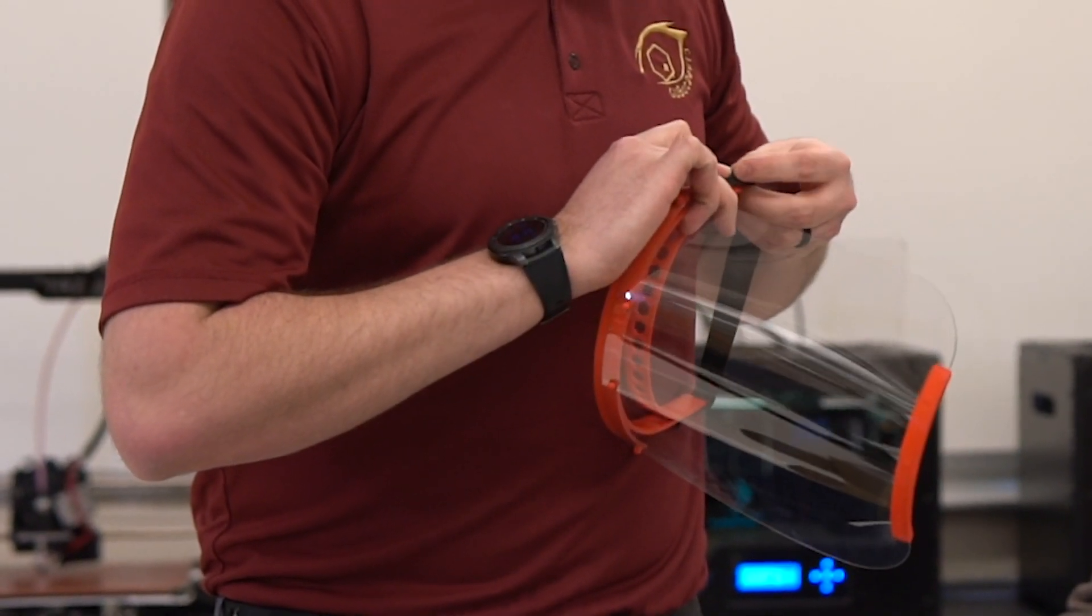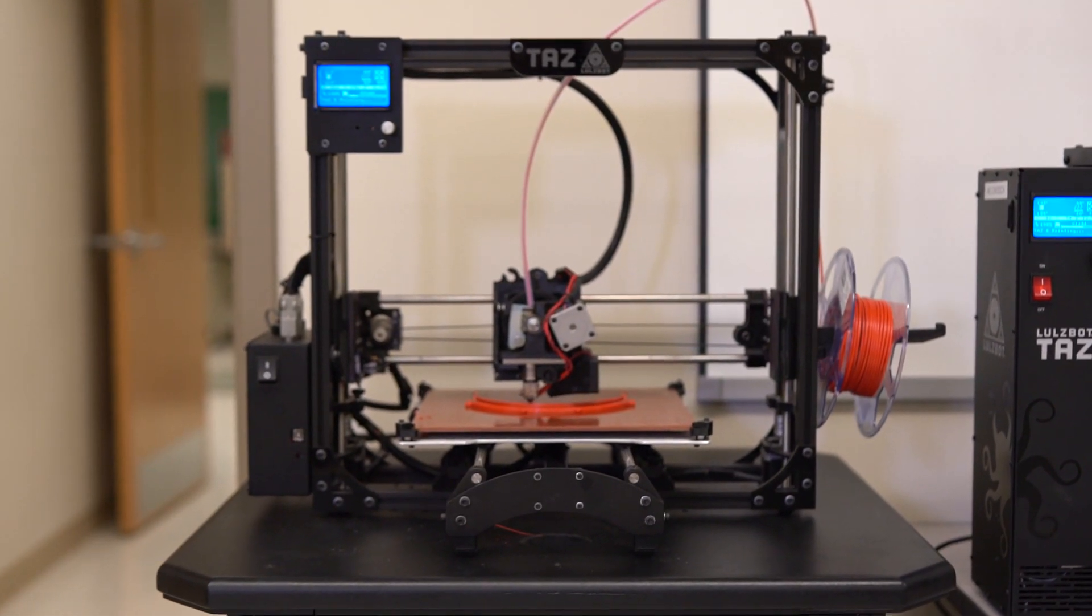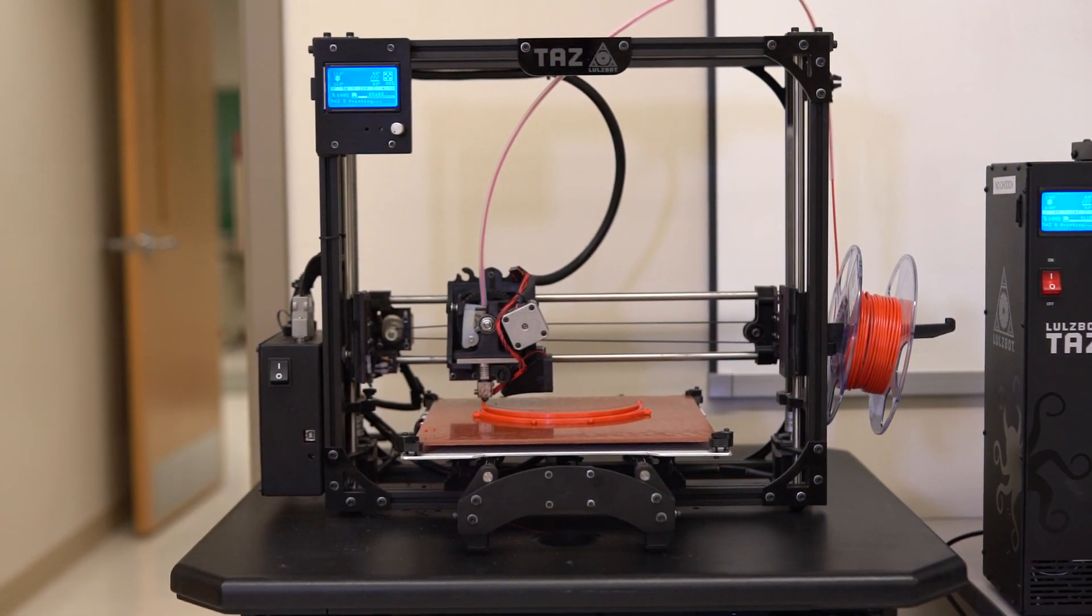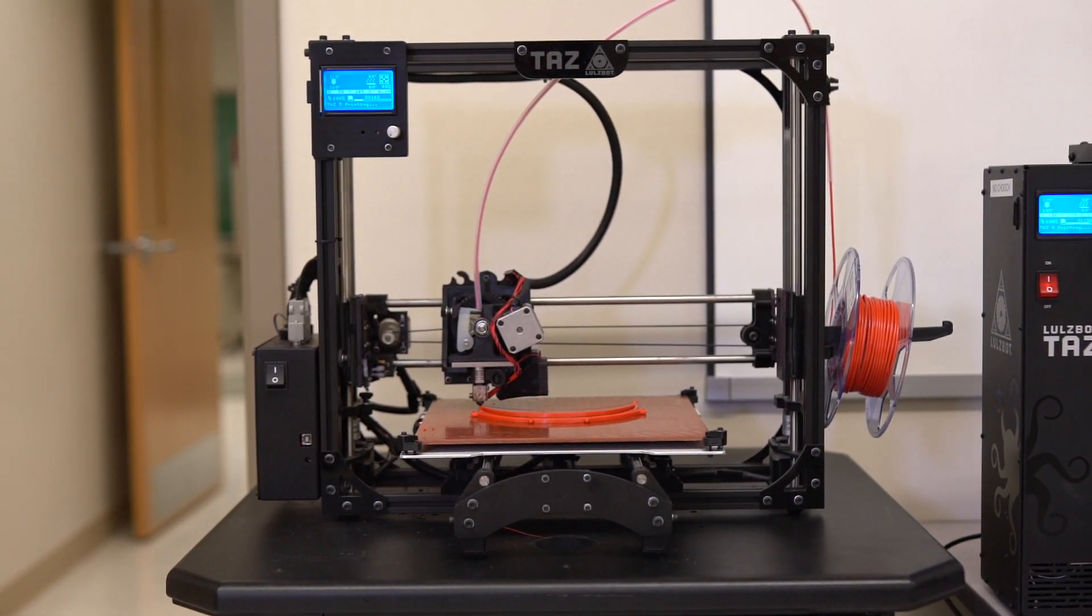Since Gannon has moved to online classes, our labs are closed. So we decided that we had a lot of 3D printers lying around the campus. And there's a movement in the open source community to 3D print and laser cut out face shields for the hospitals to use. So we found some of their designs online.